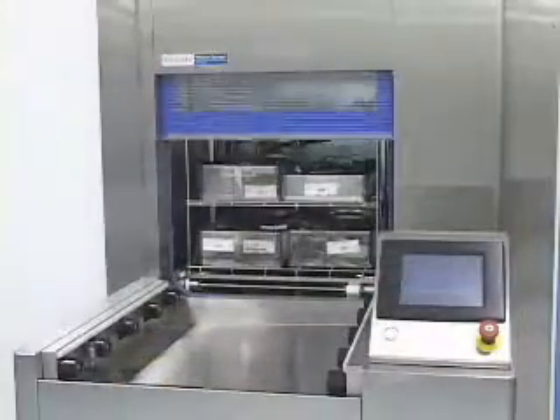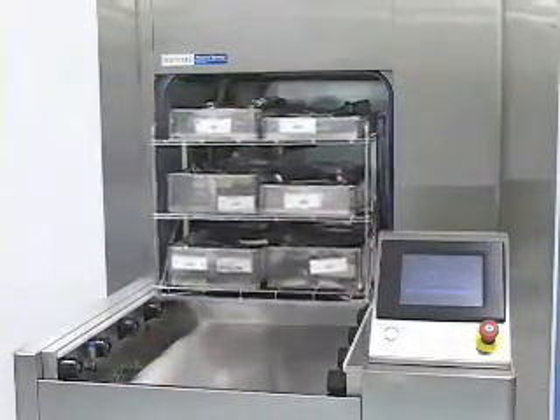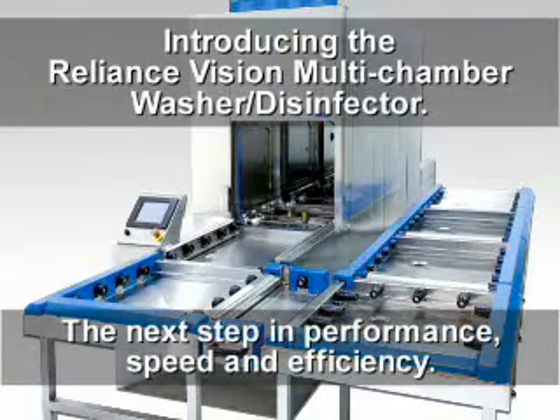Steris' long-standing reputation for designing innovative washer disinfectors continues with the development of a new multi-chamber washer disinfector that can meet all of your reprocessing needs. Introducing the Reliance Vision Multi-Chamber Washer Disinfector — the next step in performance, speed, and efficiency.